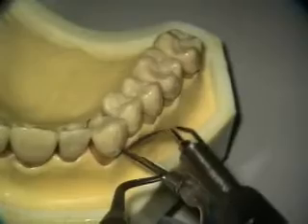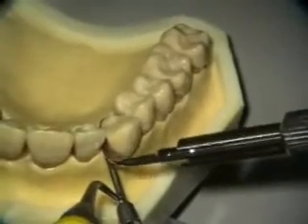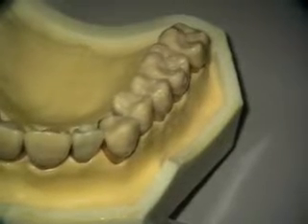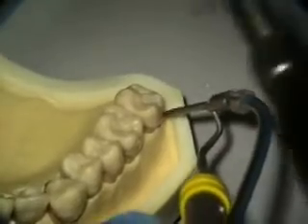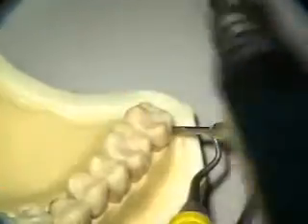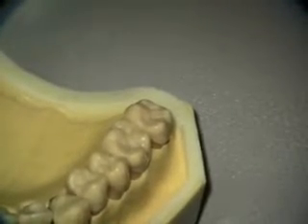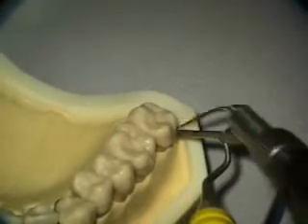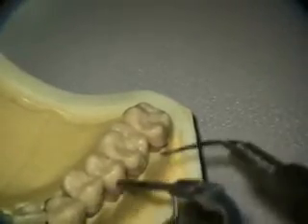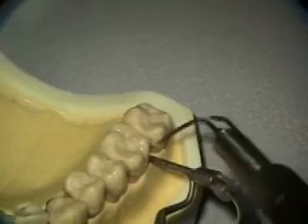It's not exactly like I'm looking at it directly, because I'm a lot further away. My focal length with loops is a lot further than the focal length of this microscope. Now I've switched to the left-left. A lot of times, because I'm right-handed and sitting at the right hand of the patient, this is easier than trying to do cross-instrumenting from the angle I'm sitting at from 11 o'clock. So I'm getting into the distal, cleaning here, cleaning here, whatever I think I've missed. If you don't feel like you've got certain spots on the distal, then you have to switch to the curved instrument.